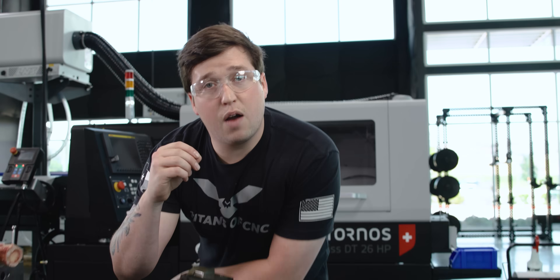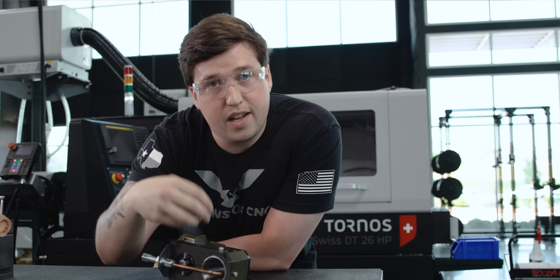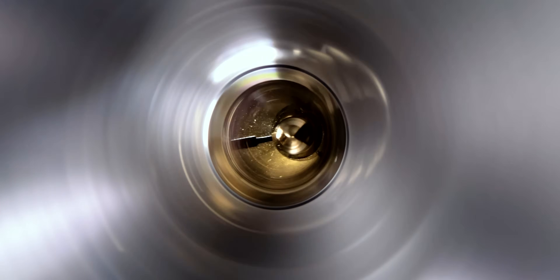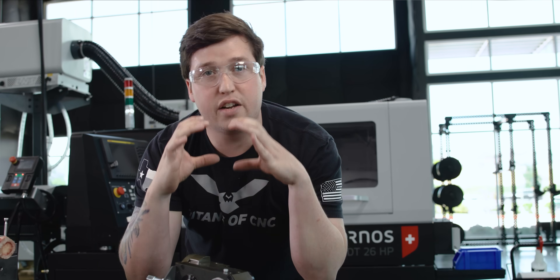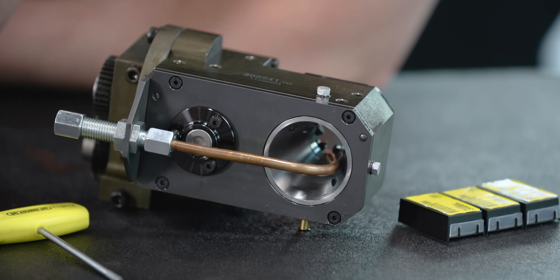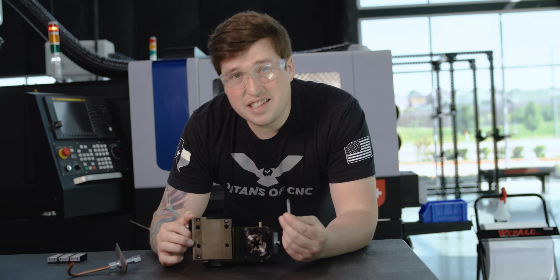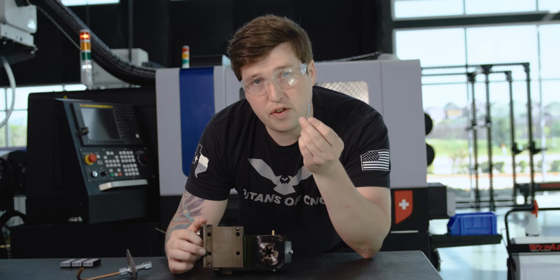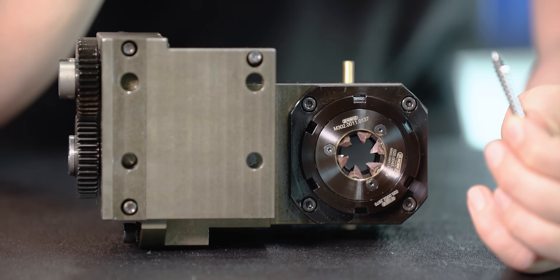One more thing about thread whirling: you really need to flush the chips out. You need a coolant line blasting all those chips out, because the centrifugal force of the holder will keep chips in there — so you really need to flush it out to extend tool life. There's a lot that goes into thread whirling, but in reality it is the easiest way to create such a perfect thread. You have the angle of your thread whirler, which has to be calculated, and the custom form of your insert that has to be made for whatever bone screw you're doing.